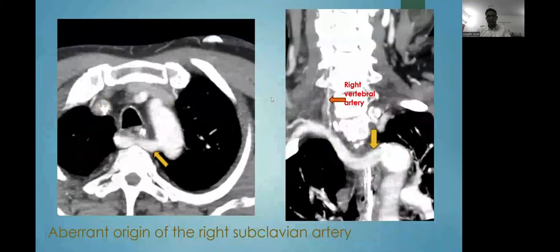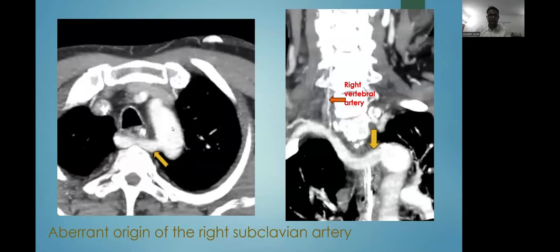The third case is the variant origin of the right subclavian artery, marked in yellow, in which the right subclavian artery arises from the distal aspect of the aortic arch. We also see the right vertebral artery arising from this variant right subclavian artery in the coronal section.